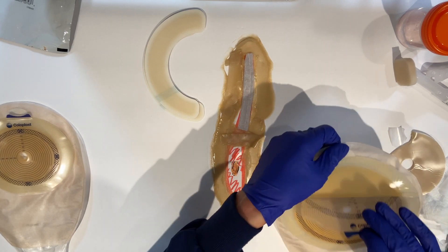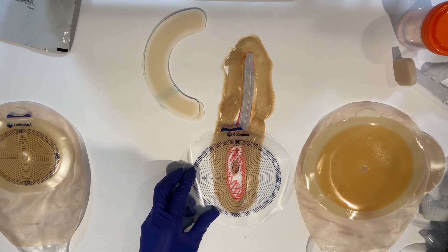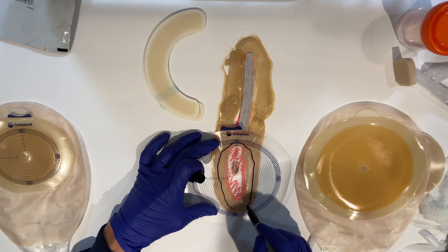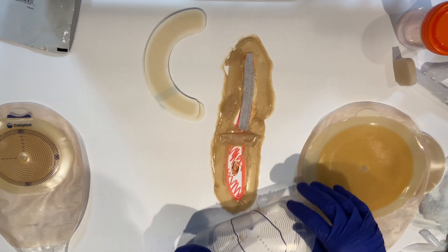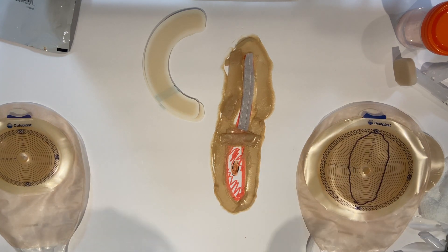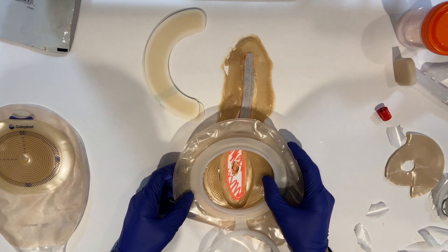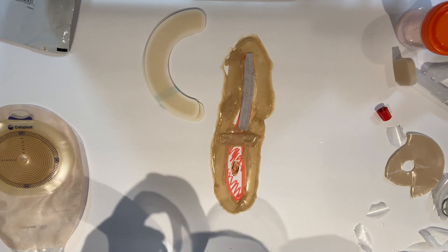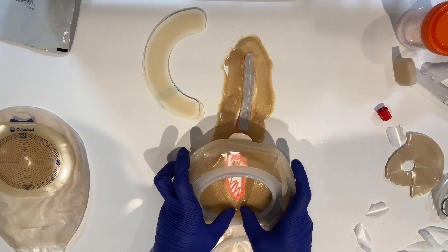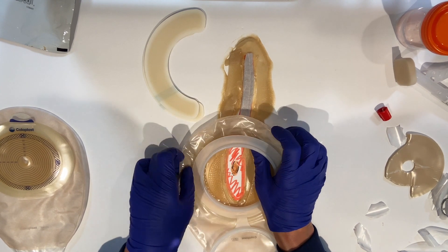This pouch looks like I can see the barrier rings on the bottom and the top, so it's going to work out great. You can freelance cut it or do a pattern — I do a little bit of both. The most important part is at the base, because the output runs downstream. We want to put this down so we can see the barrier rings underneath on both edges, and for sure at the bottom. Then just give it a little love — pat it down.